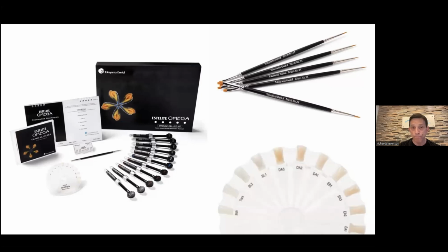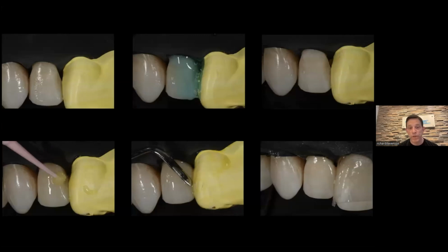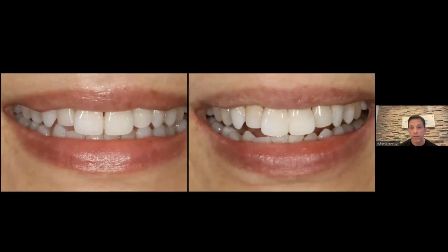And he treats live cases, actual patients in this. So I'm using the Fahl technique, and he always uses rubber dam. I'm using some Teflon tape, the thicker Teflon tape, plumber's tape, and we're going through the process of recreating the interproximal spaces in this particular patient. And it didn't require that much. It was just a few little areas, and it completely changed the patient's smile.